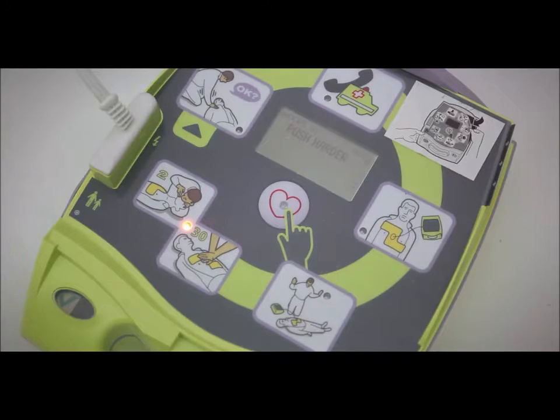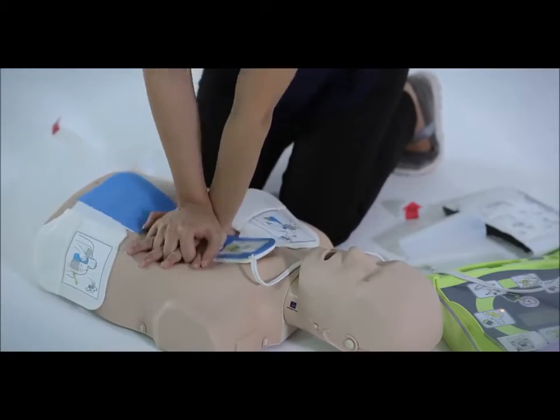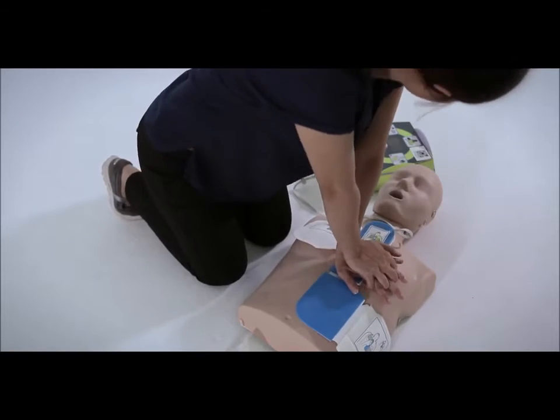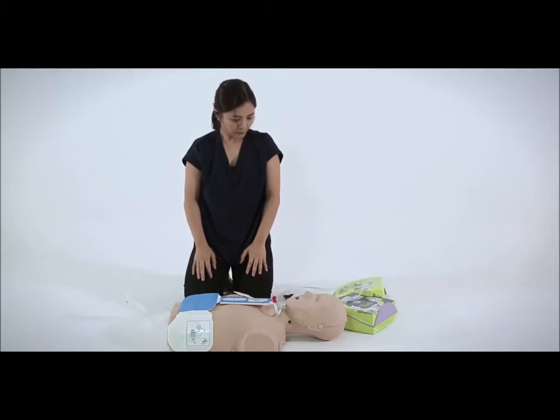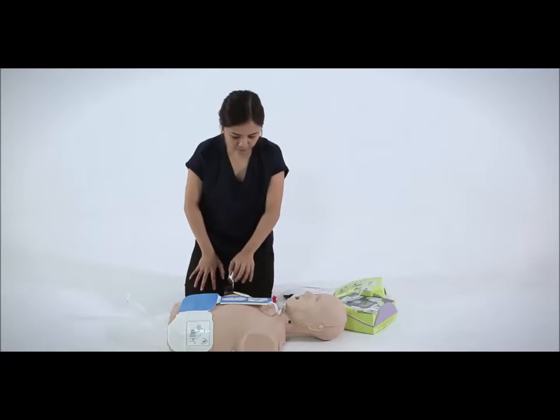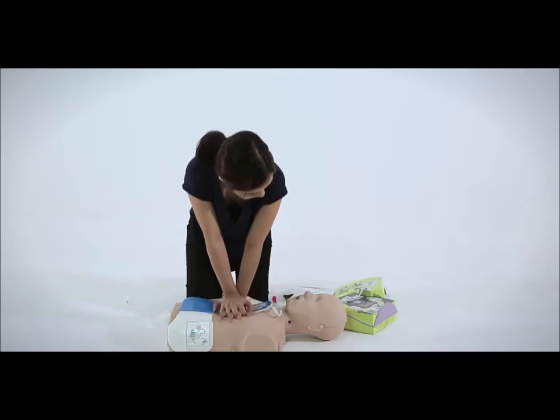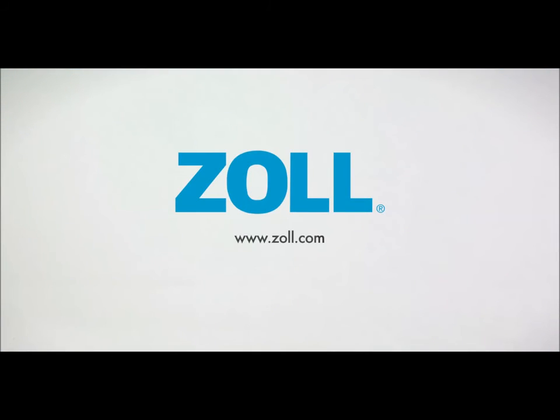If your compressions are less than 5 centimeters deep, the AED will prompt you to: Push harder. In this case, you will need to increase your compression depth. When you consistently achieve this, the AED will announce: Good compressions. If you stop delivering chest compressions and do not start within the next 10 seconds, the AED will prompt you to: Continue CPR. The AED will automatically initiate another analysis of the victim's heart rhythm every 2 minutes and prompt you to deliver another shock if required. Continue using the AED until the victim shows signs of recovery or until professional medical help arrives.